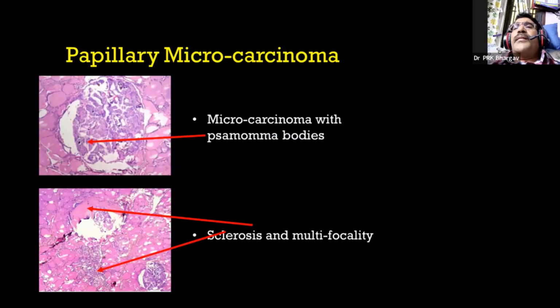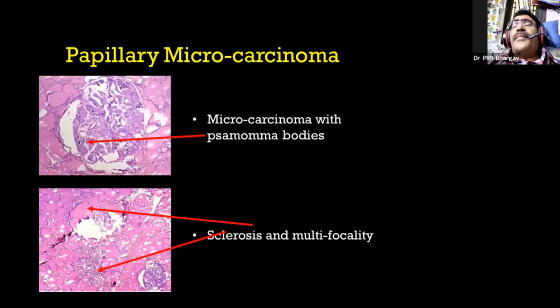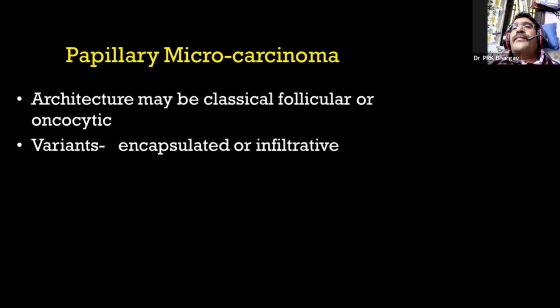So you can see the classical features will be there, but it will be a very small nodule. More often, there is presence of multifocality. In the presence of multifocality, most of these foci are micropapillary carcinoma foci. That is the importance of this one. Architecture is similar. Next.